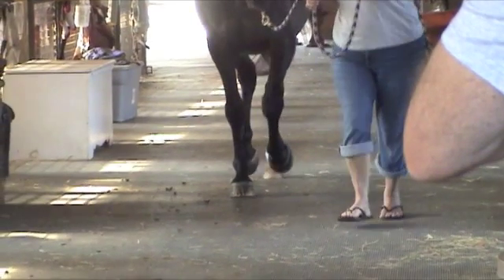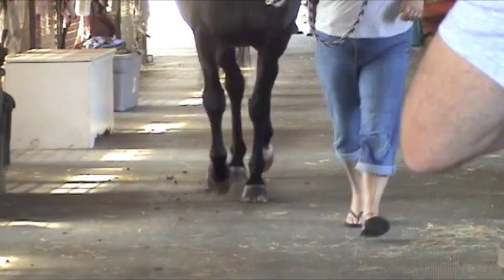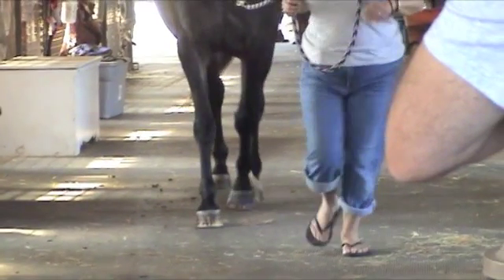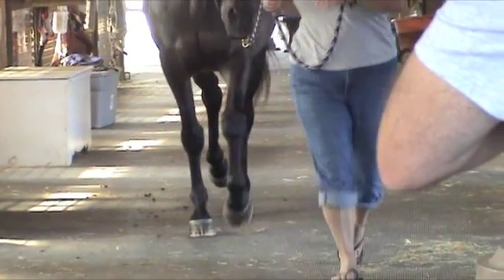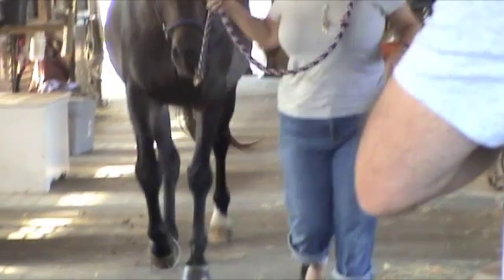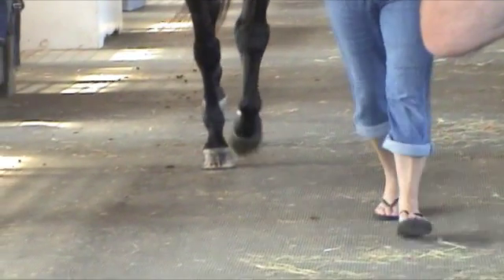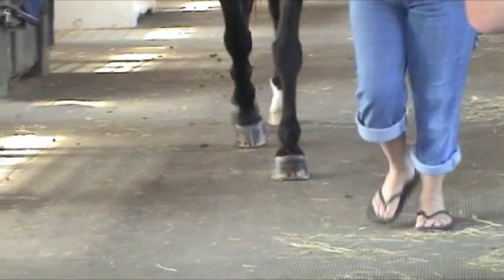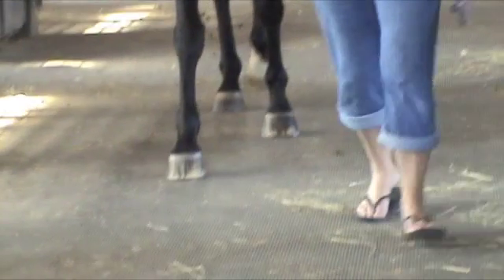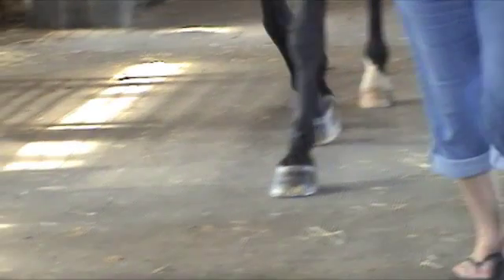Anyway, very cool working with you on this one. The x-rays — now that I get to see them here on the big screen — it's pretty clear how that fracture is attached to the front of the coffin bone and the rest of it's rotated. I don't know if that prolapse can ever be corrected, but I probably want to keep some long hoof wall to put a shoe on there and not add pressure. Anyway, talk to you soon. Bye.